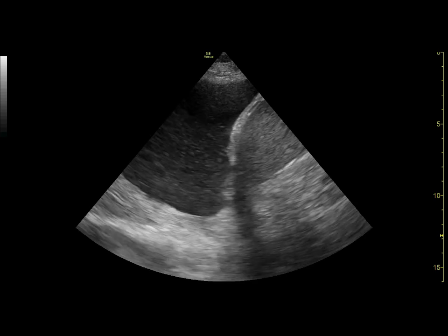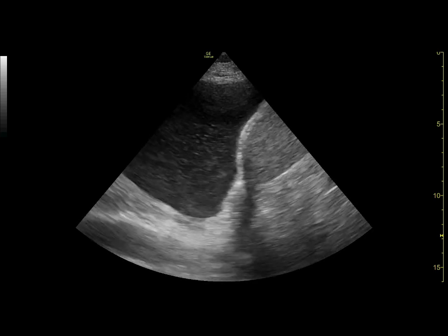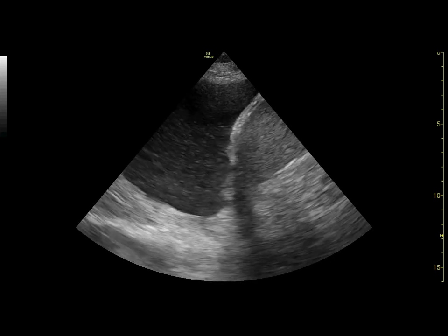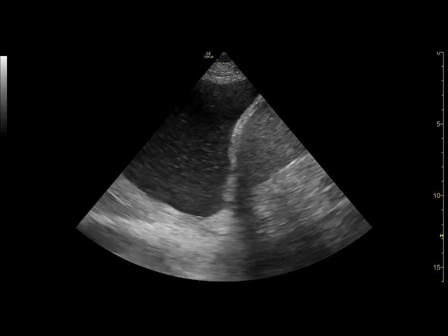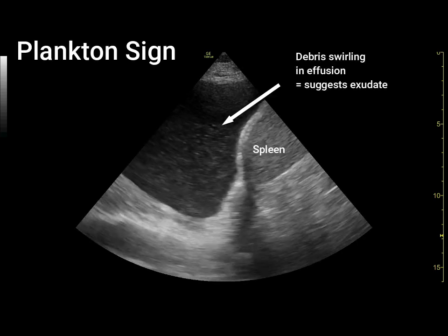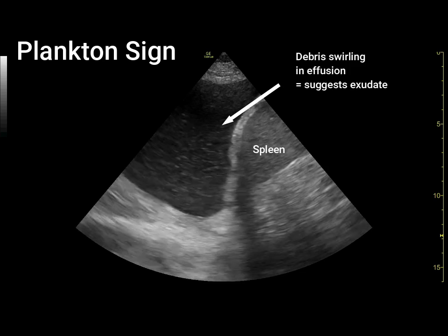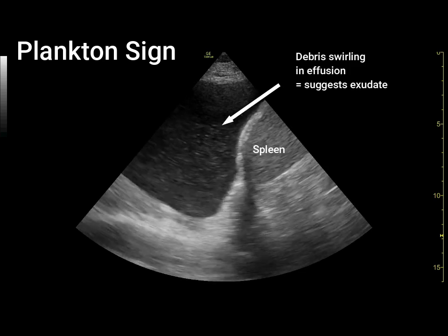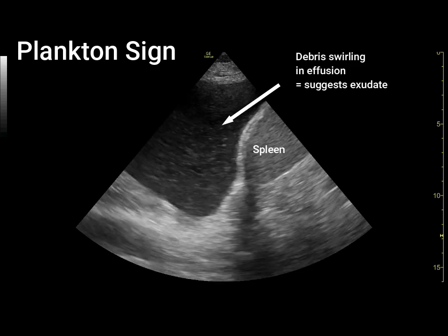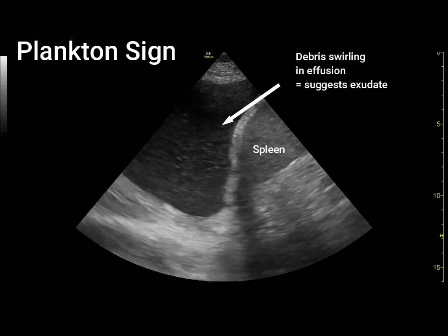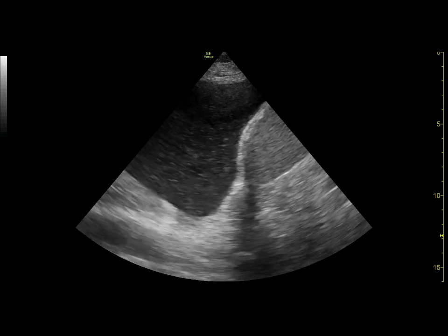Compared to the previous videos of effusions, however, rather than appearing anechoic or black, this effusion appears grainy and has a swirling appearance of debris. This is referred to as the plankton sign and is suggestive of an exudative effusion. In this case, the pleural effusion was due to malignancy.